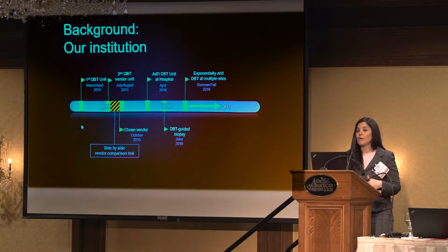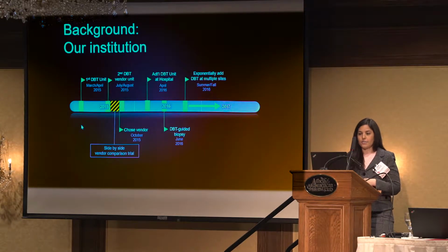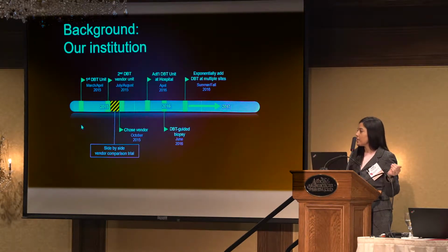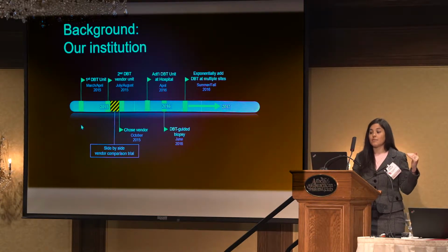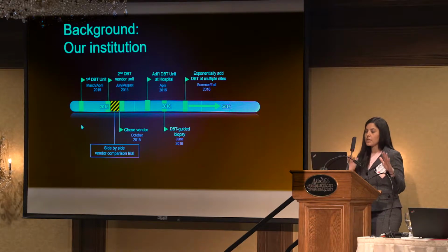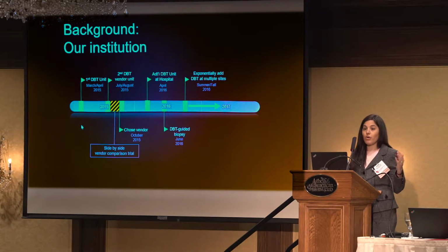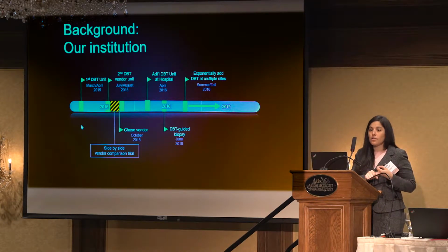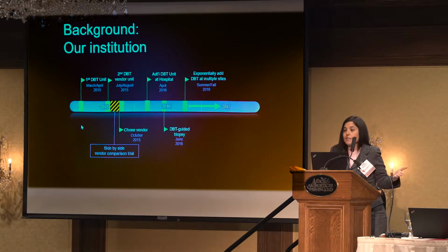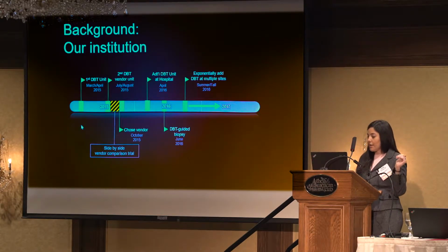We were actually approached by a different vendor asking us to please trial their system in July, August. So we actually had the unique opportunity of having 3 to 4 months of 2 different tomosynthesis vendors at our institution side by side. This allowed us to really compare the nuances about each different system and their implementation. I think we thought probably a lot more about all these little various factors: radiation dose, usability of the machines, image quality, whether or not we just liked it, what kind of overall gestalt of 2 systems side by side.